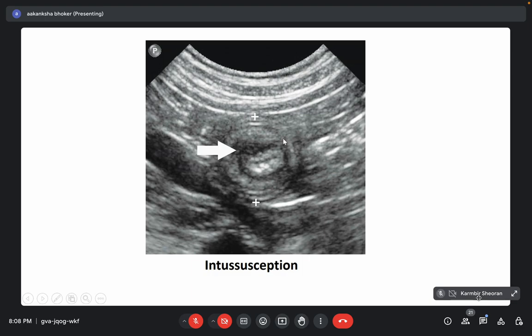Now, this is very commonly seen in young pups, a sign of intussusception. It is a target or bull's-eye appearance seen in the cross section. We can see multiple layering, target-like. It has an outer intussuscipiens and an inner intussusceptum. Also, this hyperechoic area is associated with mesenteric fat.